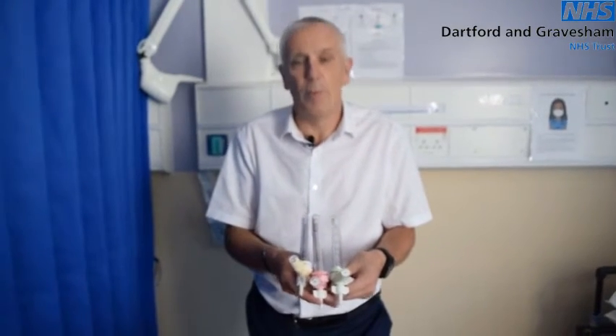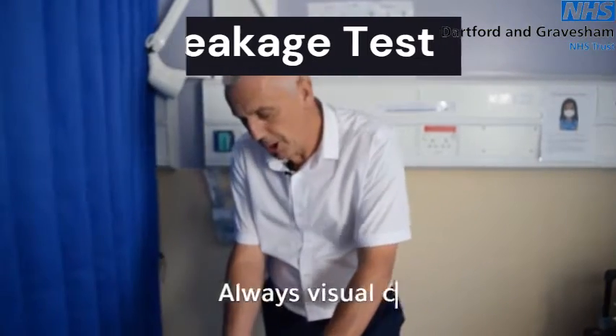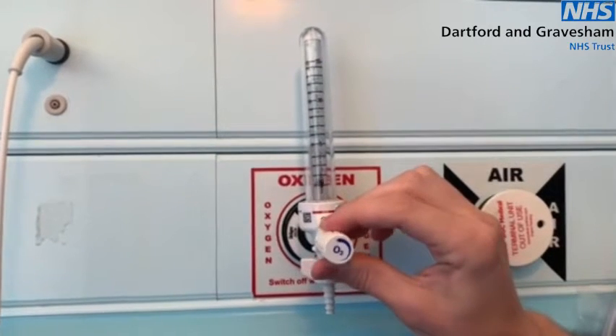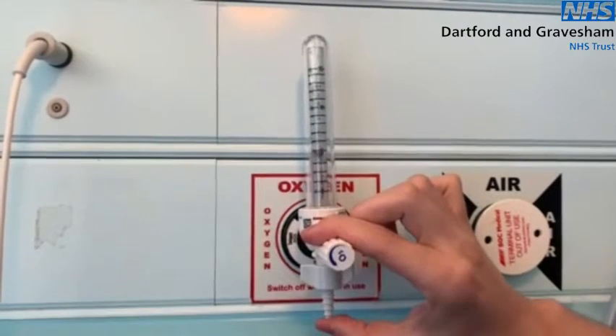Always ask the question if the flow meter doesn't look like a standard flow meter. Testing a flow meter is very straightforward. Go to the unit, turn the flow meter on — it's irrelevant where the ball sits. You occlude the tubing nipple at the bottom and the ball should drop to the bottom and remain still.